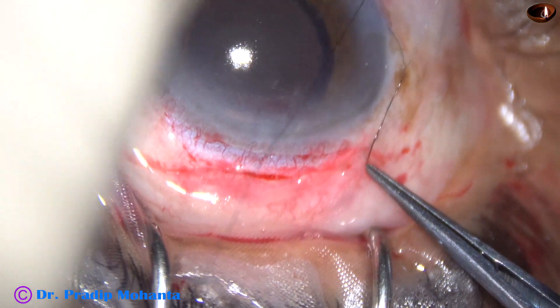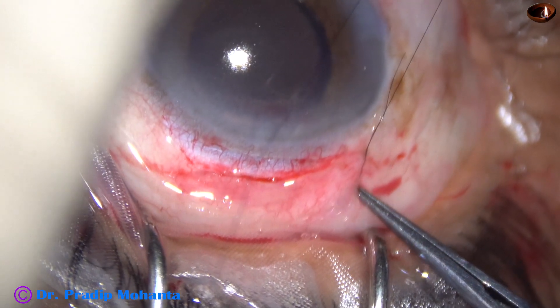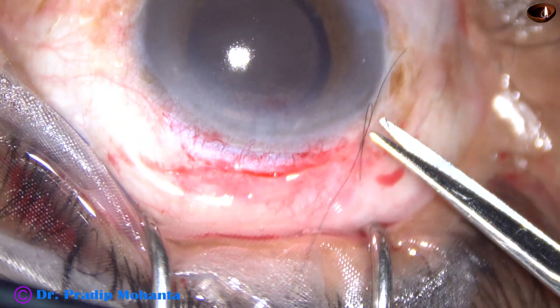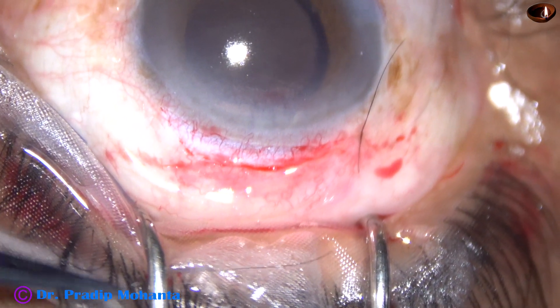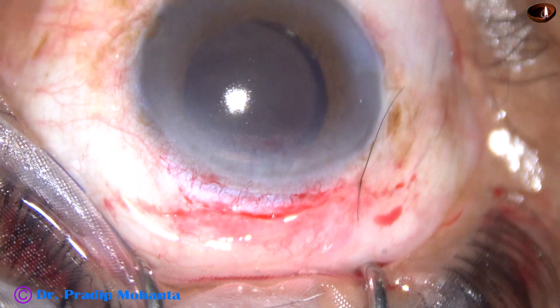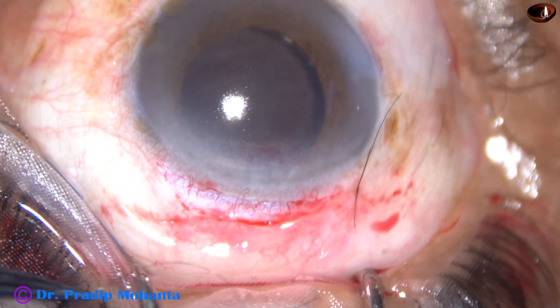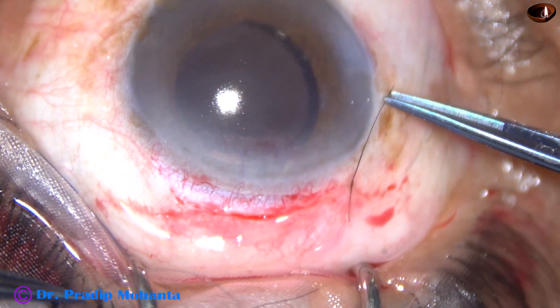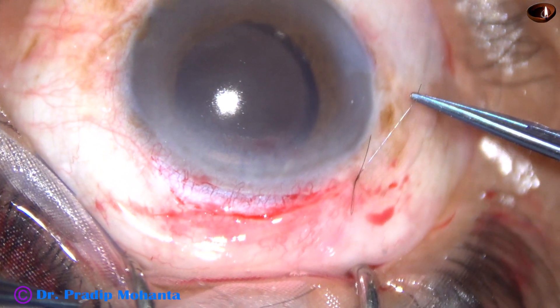And just pull it. Now, cut the thread with the needle short. And now, if you pull the longer thread while the patient is sitting at the slit lamp, it will come out like this.